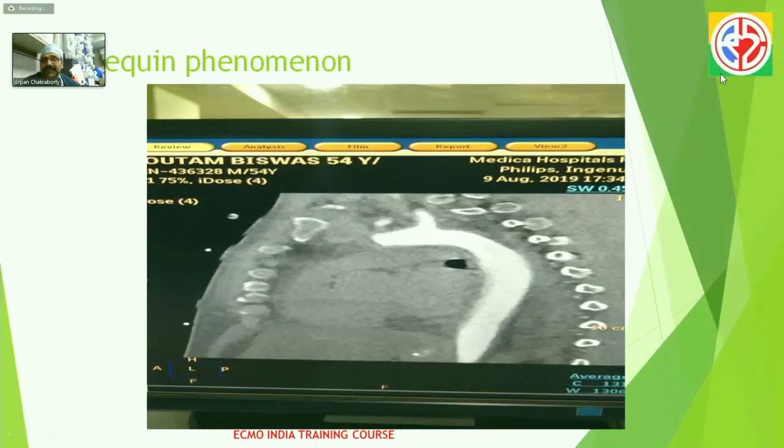We started with CT angio, where we could demonstrate the Harlequin phenomenon. This flow is from the femorals, which is going up to the arch, and the rest of the flow here is coming from the native artery. So there is a big Harlequin mix at that point of time at the level of your aortic arch. So Harlequin is demonstrated over here by your CT angiogram, CT aortogram.